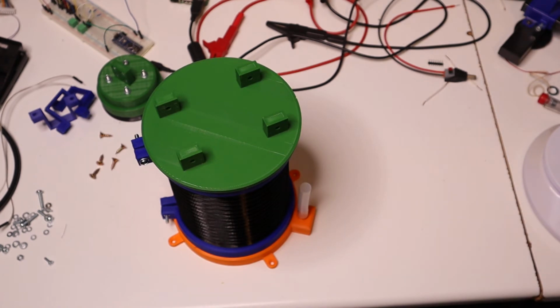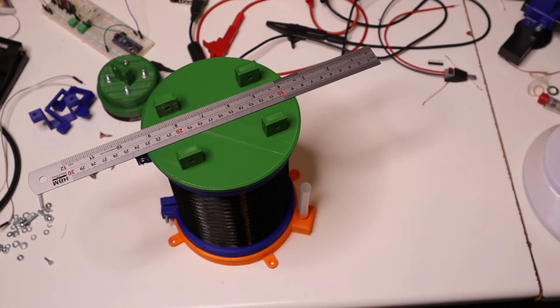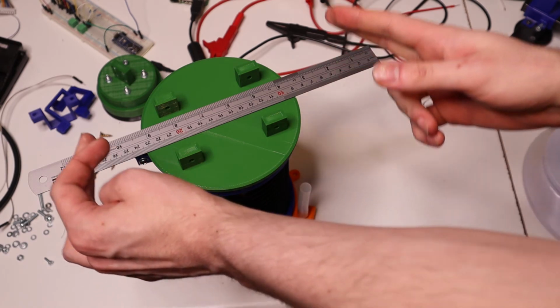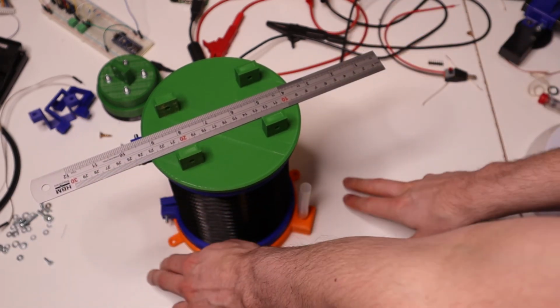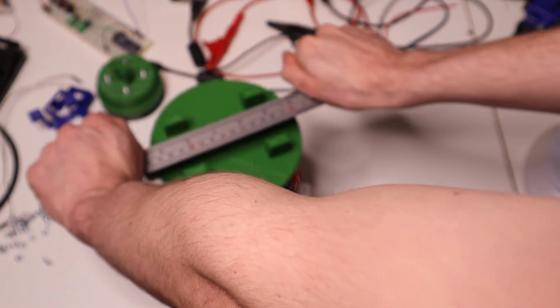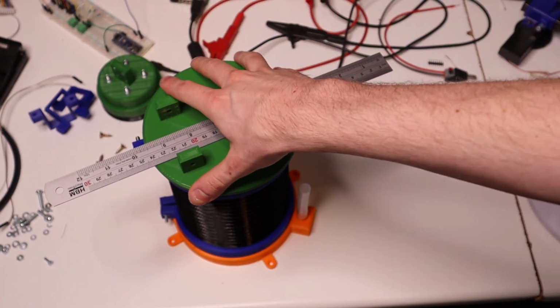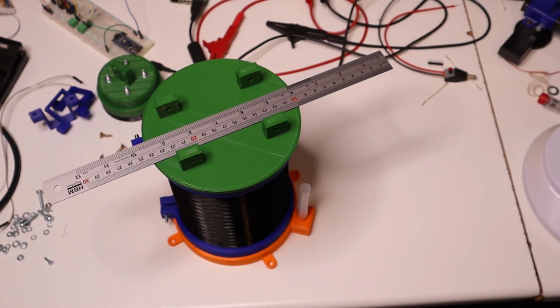And so what I'd like to do now is put a bar over the top, something like this. I want to have two lead screws come up. And then if you use two motors to turn the lead screws, then this bar will go up and down. And that way you can have motorized control of the bellows. And in that respect, it looks completely the same like the piston pump, except the leakage.